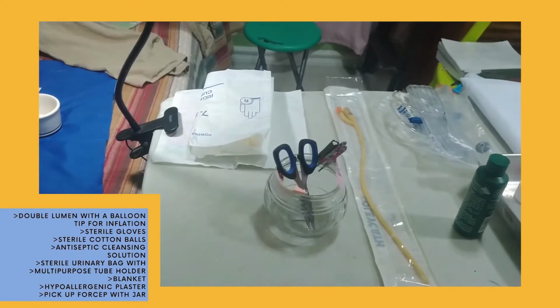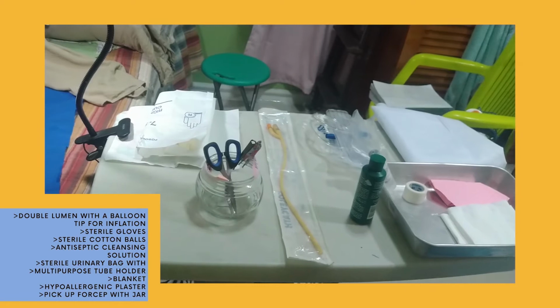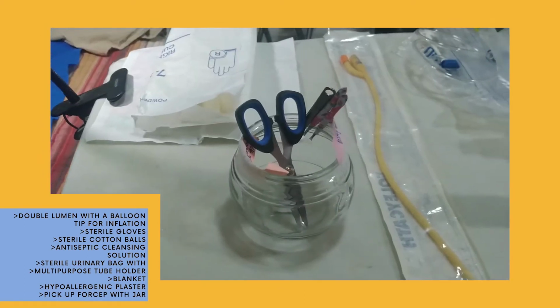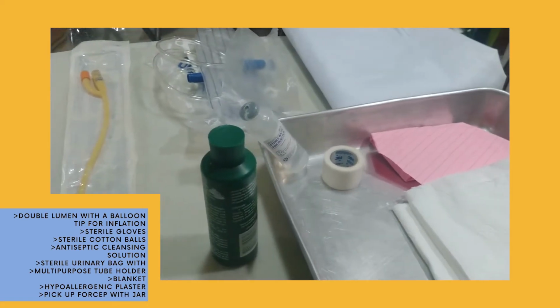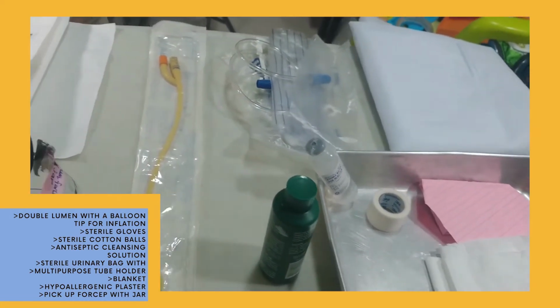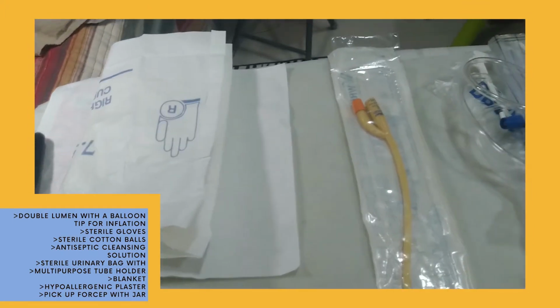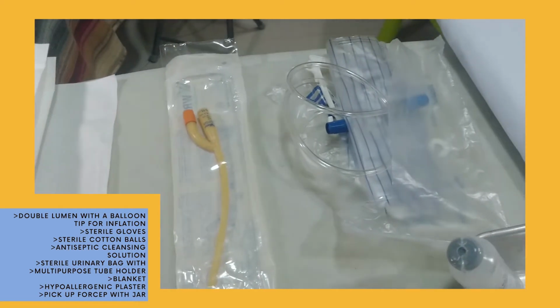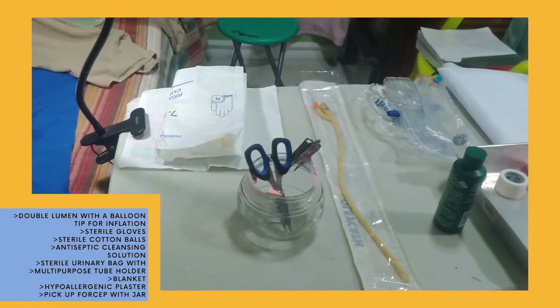Double lumen or triple lumen catheter with a balloon tip for inflation, sterile gloves of appropriate size, sterile cotton balls, antiseptic cleansing solution, sterile urinary bag with multi-purpose tube holder or tape, sterile water to inflate the balloon, sterile urine specimen container, blanket or top sheet, hypoallergenic plaster, and pickup forceps with a jar.